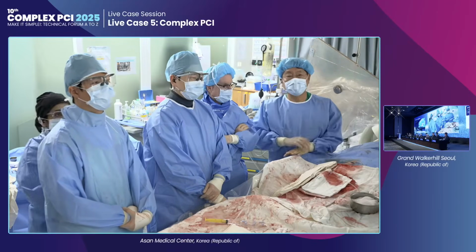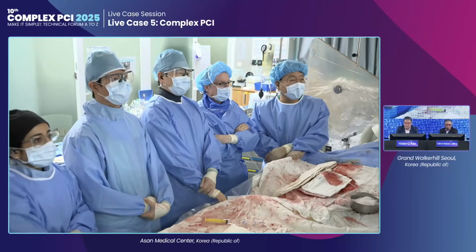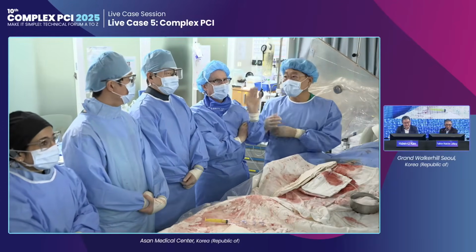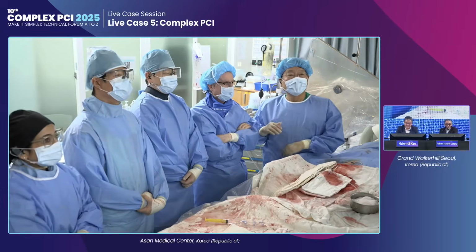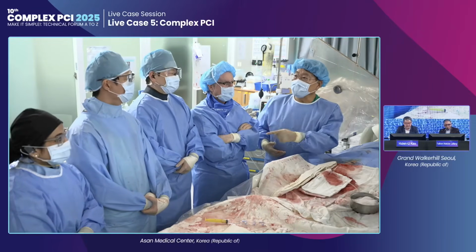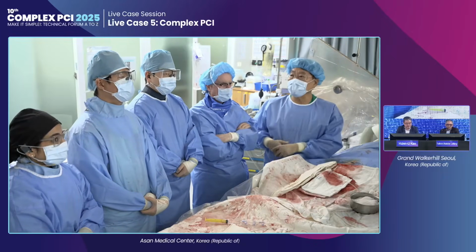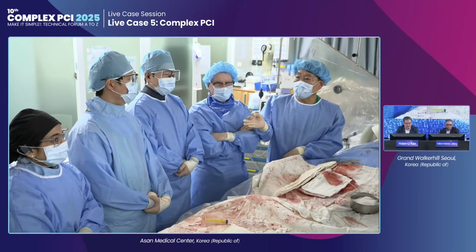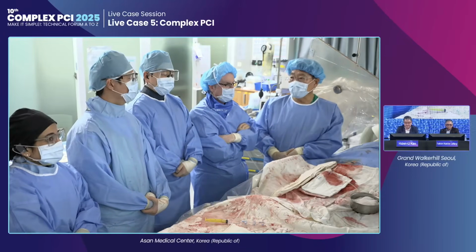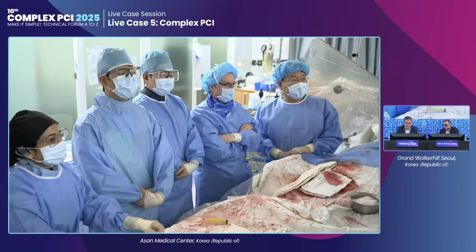Okay, thank you for joining us up to this long day, late evenings. I'm very happy that our legend Antonio Colombo, a really old friend, is getting together. I'm very happy and honored. And Dr. Kim Joo-hyun is our junior colleague, new family, and maybe he will grow. Dr. Iman from Bahrain is our fellow. So, we're going to prepare the last cases. And so, Iman, you present the case first.